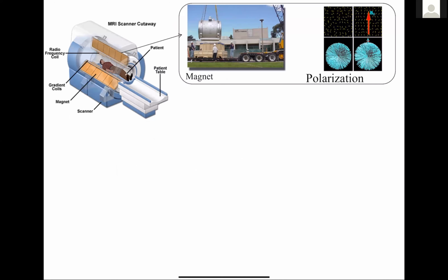Okay, that's better. So last time we talked about the four main steps of what's needed for MRI. The first thing we talked about, remember, was the big magnet, and that was polarization. Polarization is the act of creating some net magnetization. Without any applied magnetic field, there would be zero net magnetization, right?